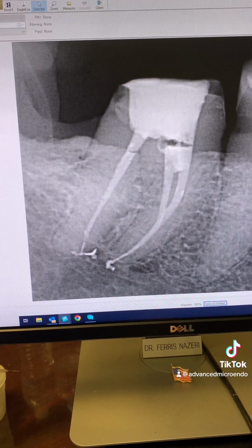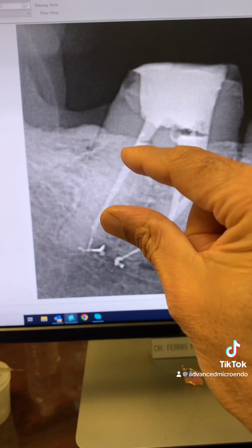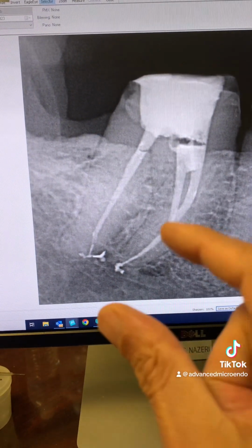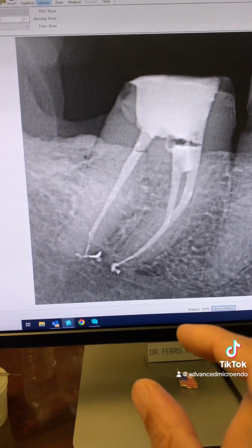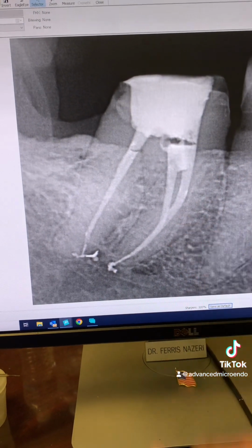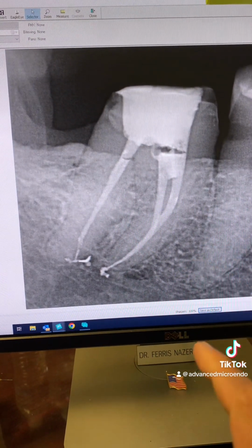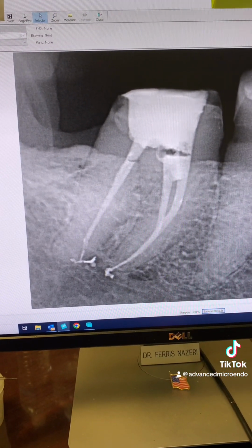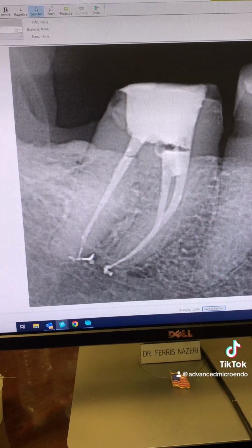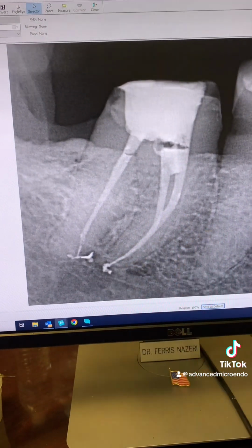You can easily perforate a tooth like this with the patient opening this much, less than a 2-year-old kid. We can fit that small child-size bite block in a 3-year-old's mouth, and we couldn't fit that in this patient's mouth. We could not. So these are not the cases that a general dentist really wants to tackle. You can use your time and energy doing a lot of more productive things than spending time on a case like that.